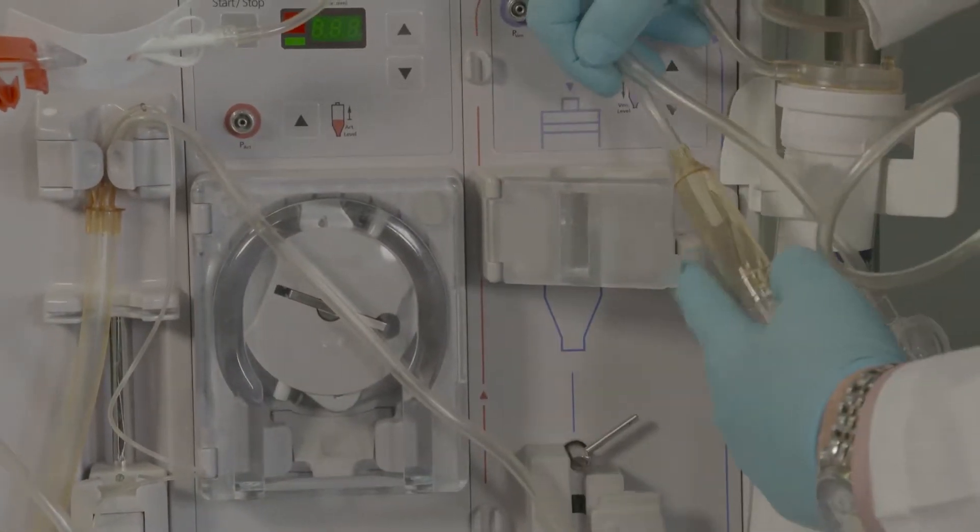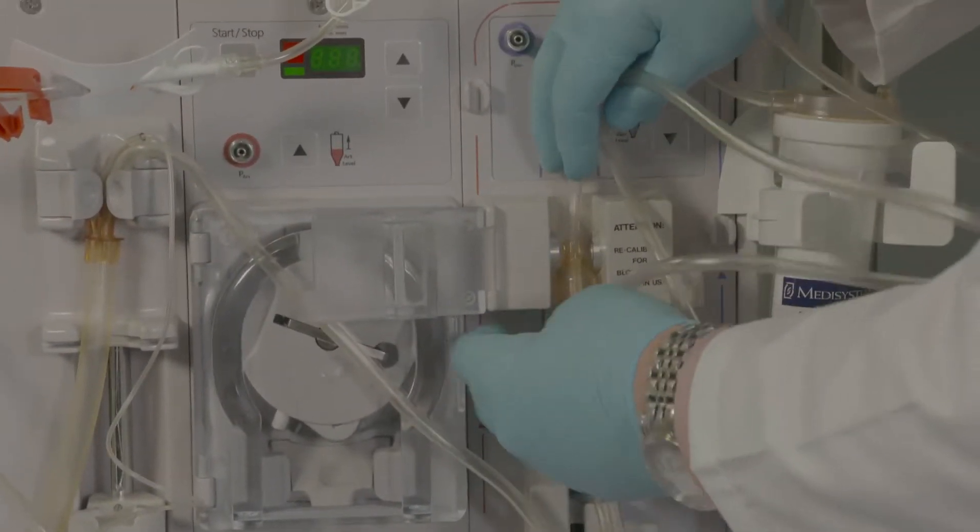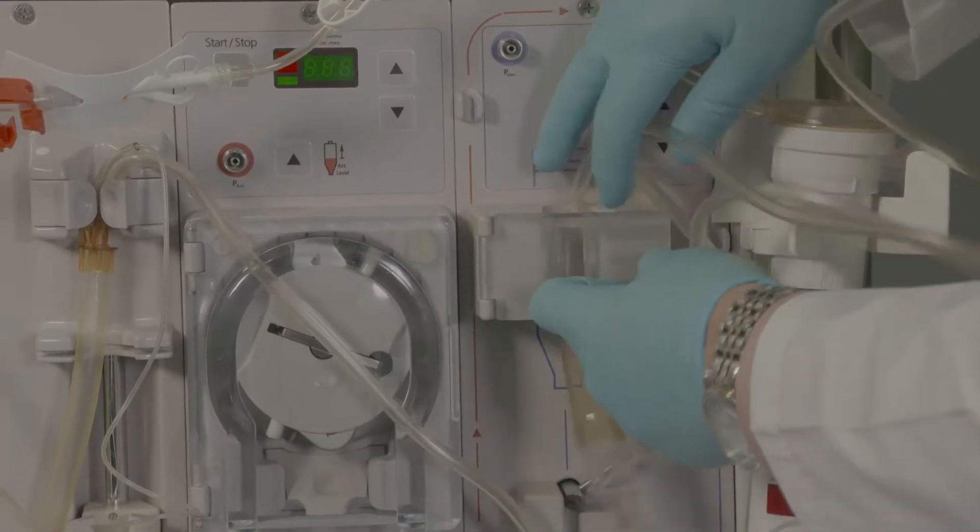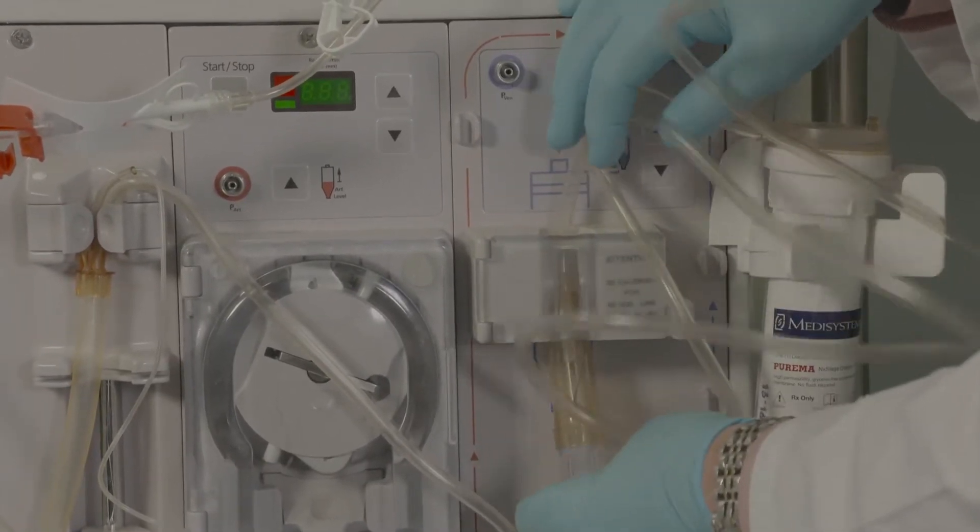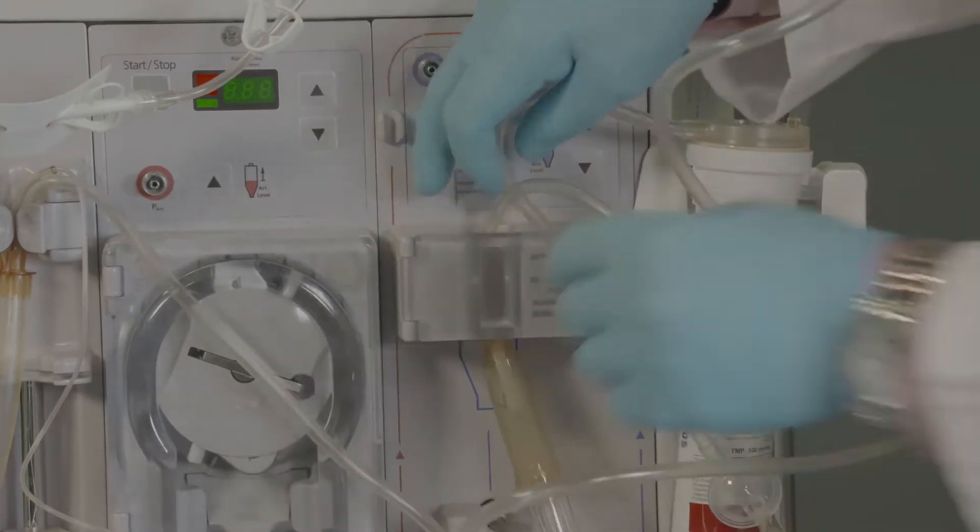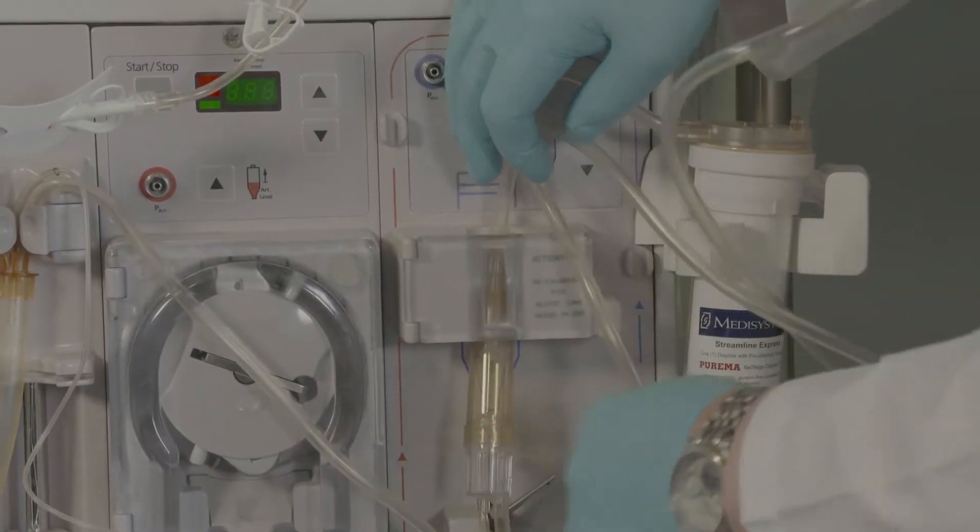Here, SLE is already hung on a Fresenius 2008K dialysis machine in the optimal way to enable air removal. The venous chamber is upside down. The arterial pod is below the heparin line, hanging vertically.